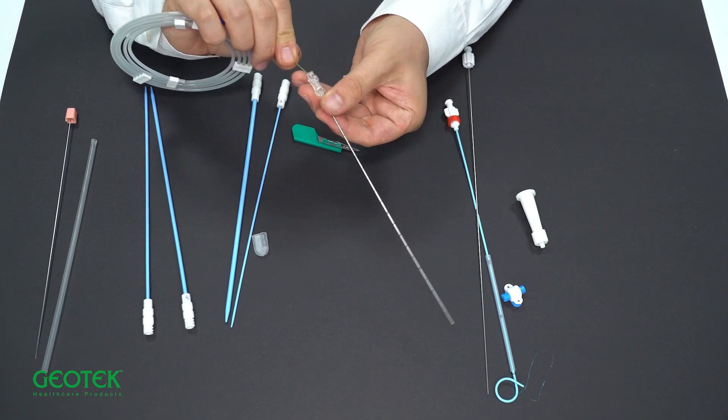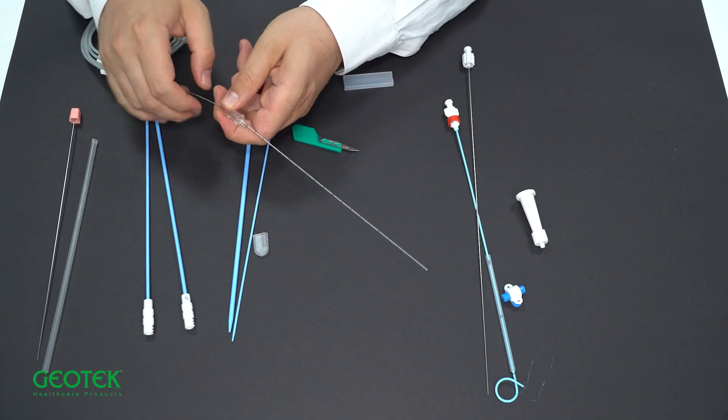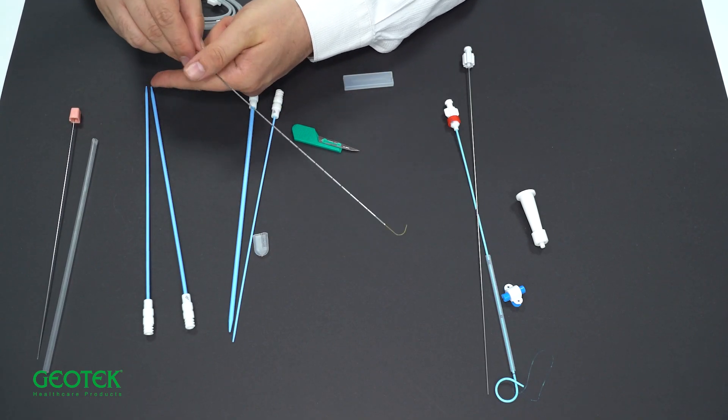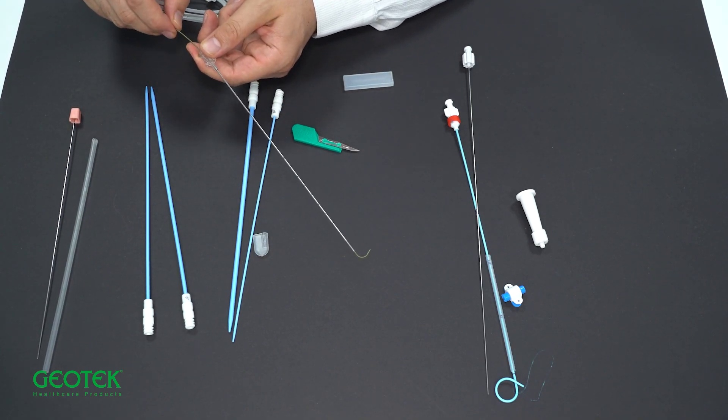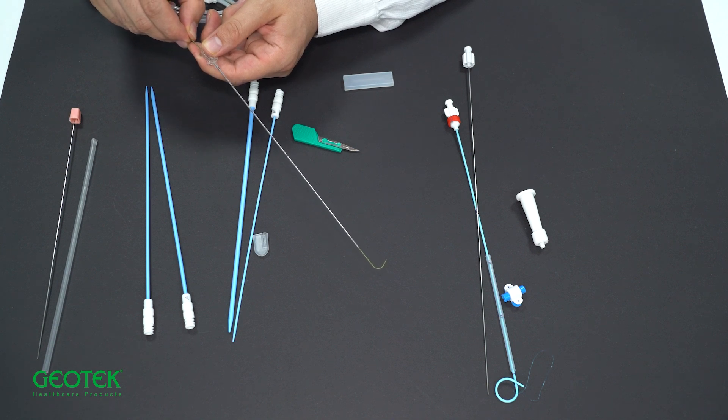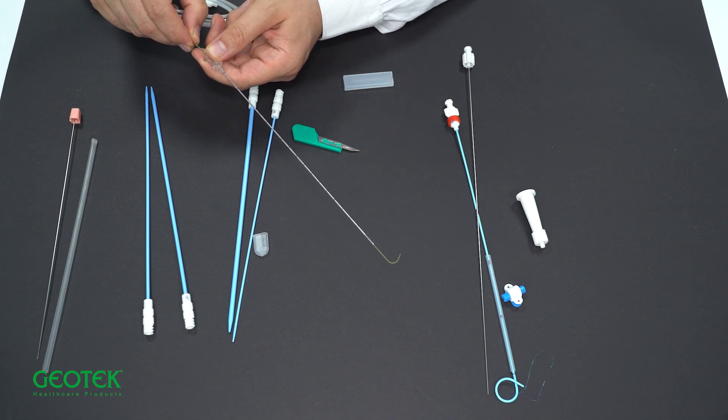A guide wire is sent through this introducer needle. This wire is hydrophilic and has a soft tip. The wire is sent.